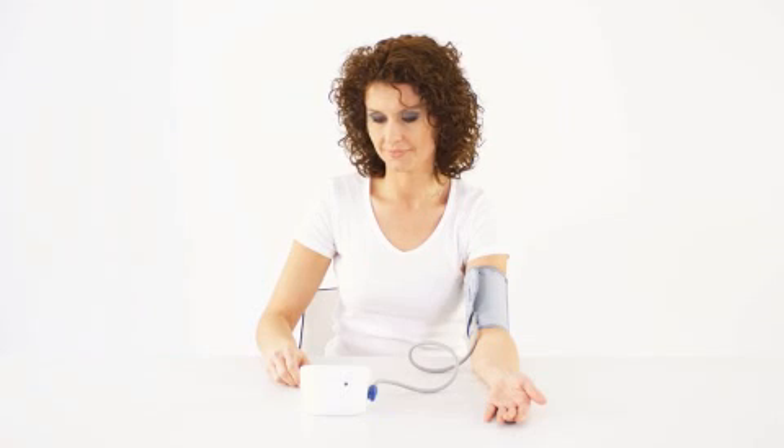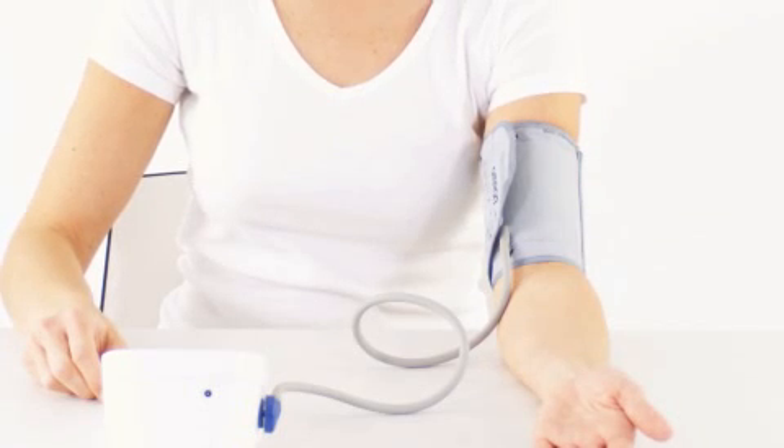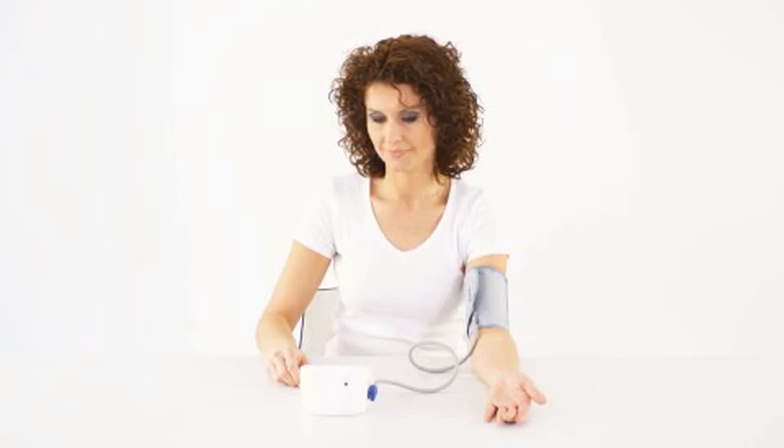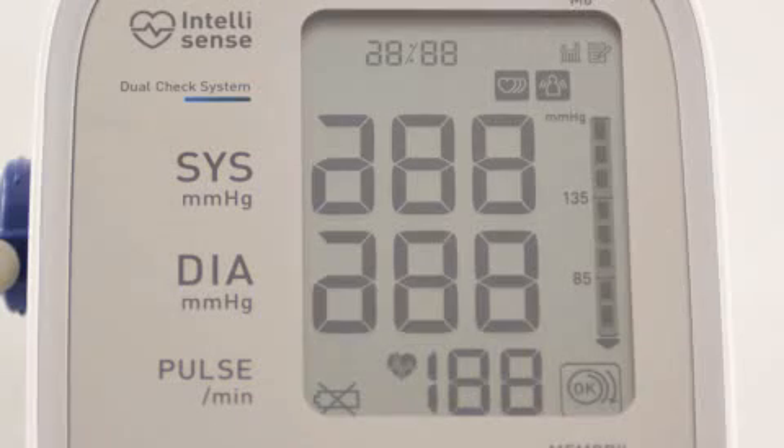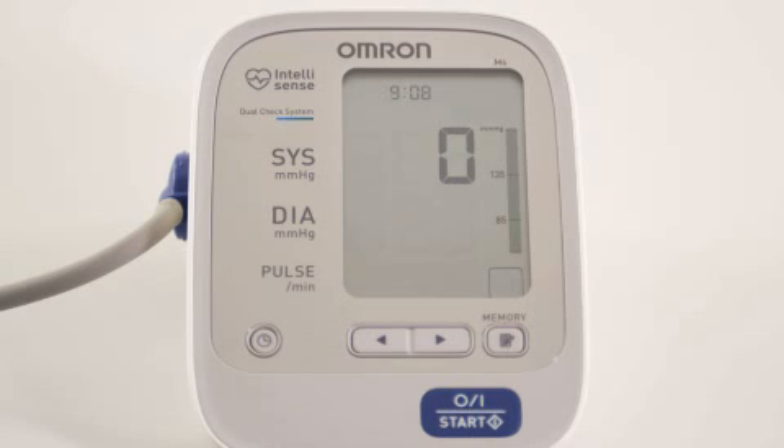Sit still in an upright position with a straight back. During the measurement, the cuff should be at heart level. Press the on-off button. The cuff wrapping logo appears on the screen and the cuff starts to inflate automatically. The dual check system ensures correct functioning.